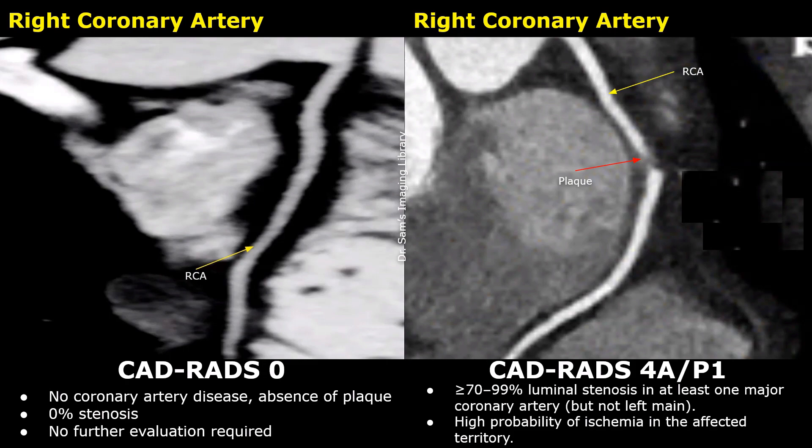Plaque burden is P1 because only one artery has plaque. CADRADS-4A is a serious condition. There is high probability of ischemia in the affected region of the heart.